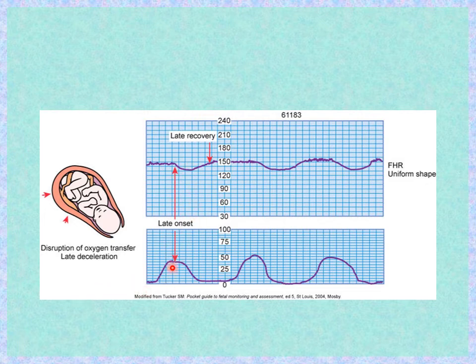If you see in this here, you see that the contraction is peaking here. The deceleration does not start until after the peak of the contraction. It does not return to normal until after the contraction is over. You see this with each and every one of these decelerations on this slide.